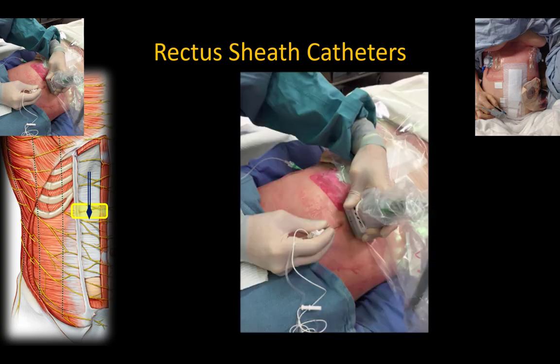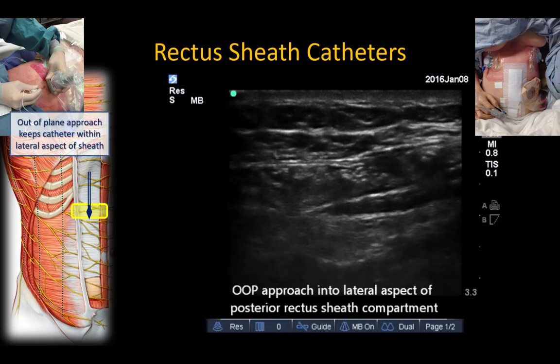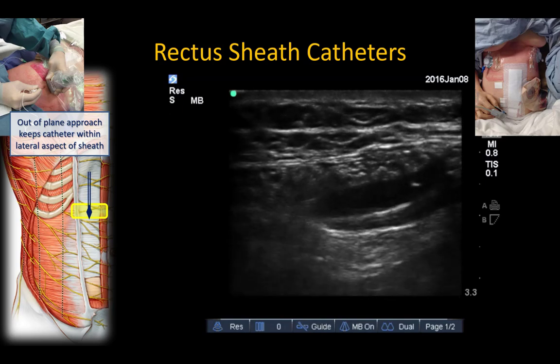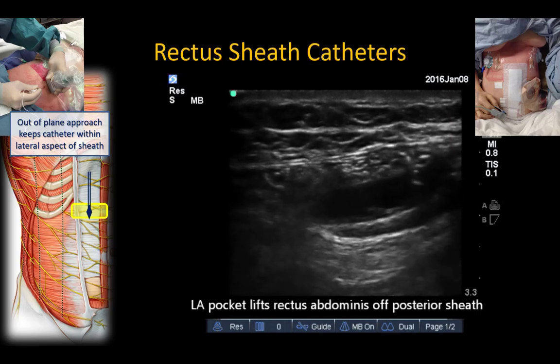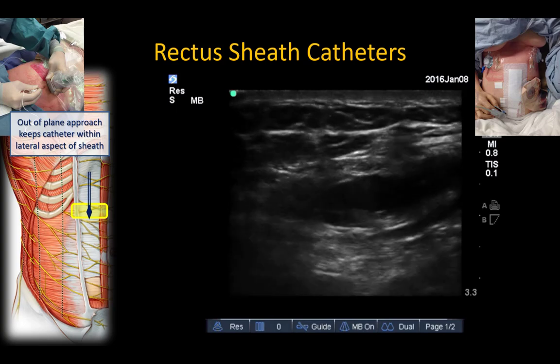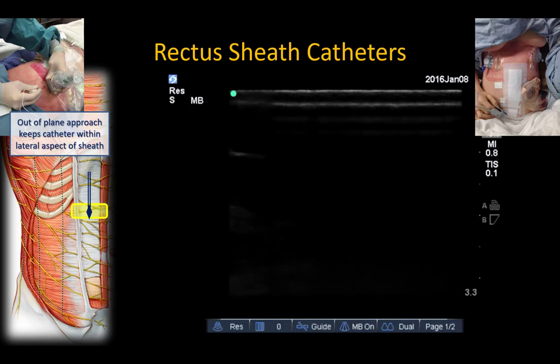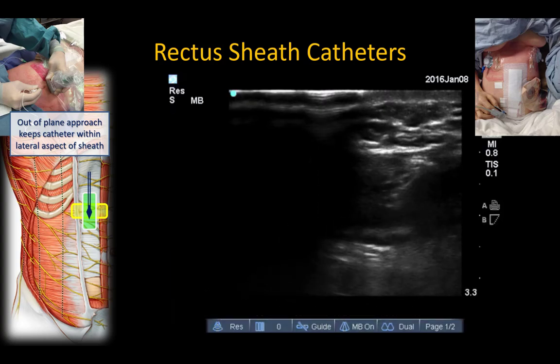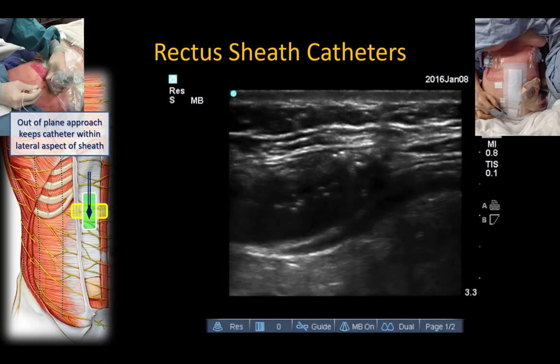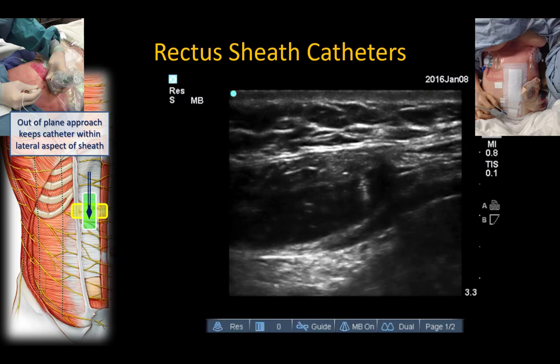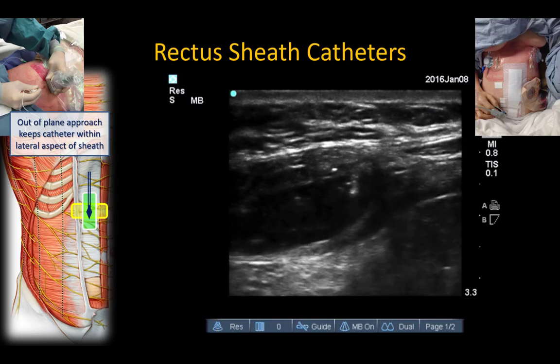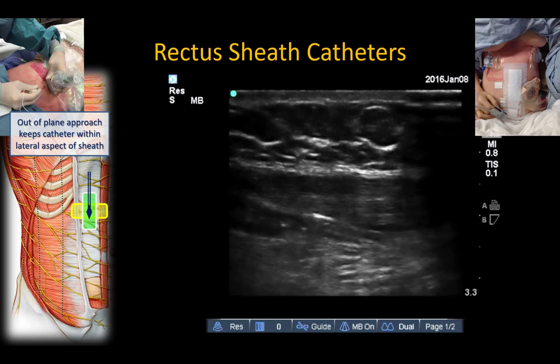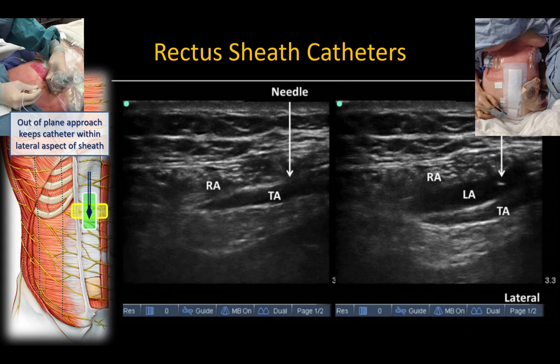Here a catheter-over-needle set is used. An out-of-plane approach with transverse imaging is preferred so that the catheter remains within the lateral aspect of the sheath throughout its course. Hydrodissection confirms spread in the correct location between the muscle and the posterior sheath, and the tip of the catheter needle can be seen. The probe can then be turned 90 degrees into a longitudinal in-plane view to confirm the trajectory of the needle and catheter and the subsequent spread of local anesthetic, and also to confirm final catheter position. An intermittent bolus dosing regimen every six to eight hours is preferred, but continuous infusion can also be used.